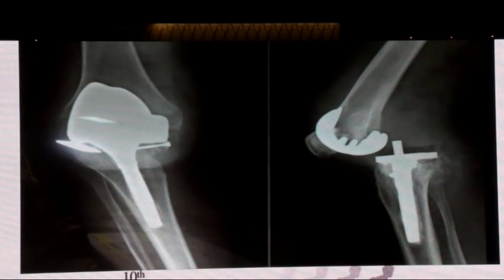But this kind of knee should possibly have been treated with one of the inserts which are more stable. There are two or three in the market which are compatible with the knee that you are doing. One of them is the Smith and Nephew, where you have a thicker post, and with that you get greater stability. So this should have been anticipated, so that greater stability between the femur and the tibia was achieved. They looked after the tibia to tibia by putting the rod, but I think this is what was missed.